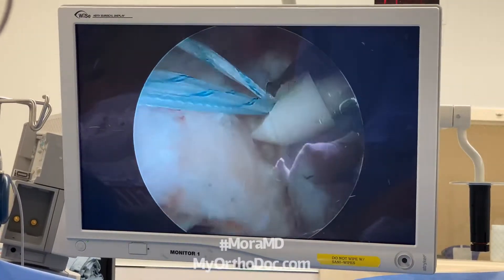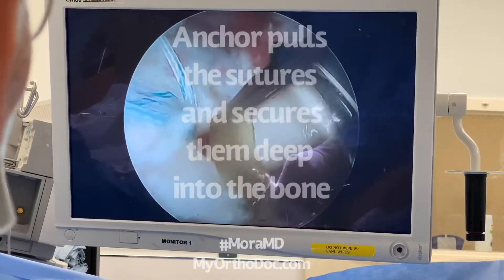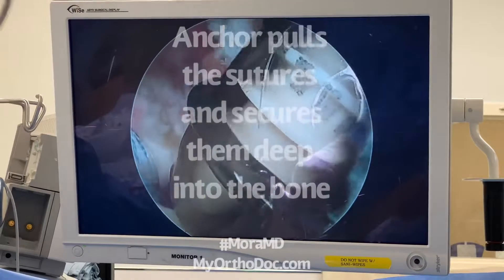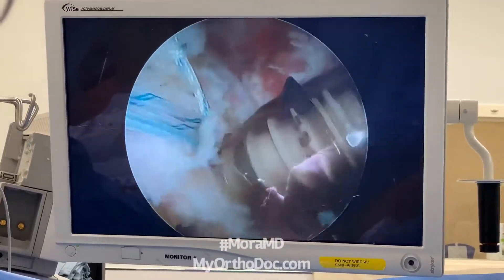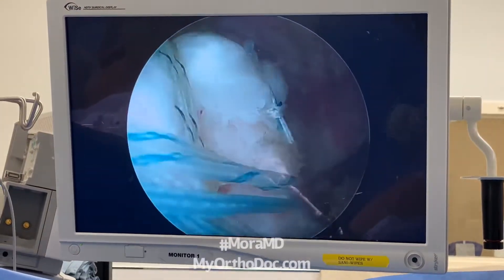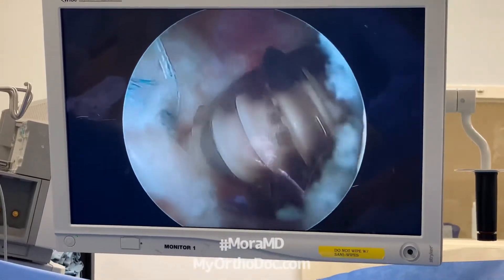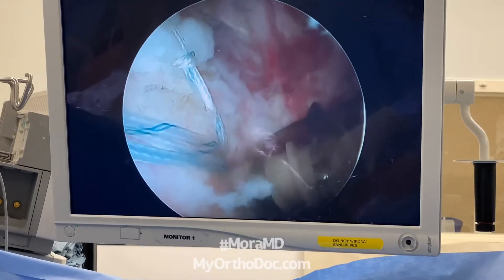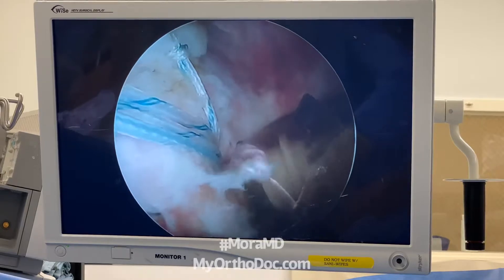It will be held with a Smith and Nephew multi-fix type anchor. Let's go ahead and start hitting it right there — it's a self-drilling type of anchor. Pretty soon you'll see some threads. Once the threads hit the edge of the bone, I screw it in. Stop right there, good. Before I do the final fixation of this anchor, which just pulled in some sutures, I tension my sutures like this — everything has to be tight.